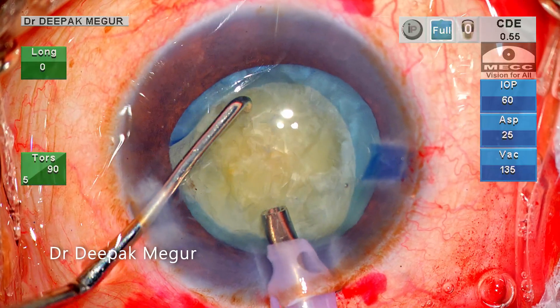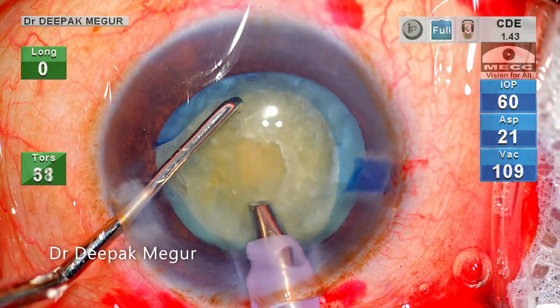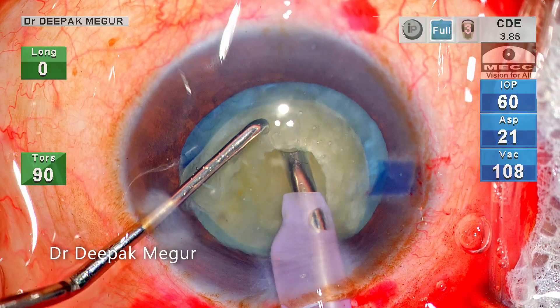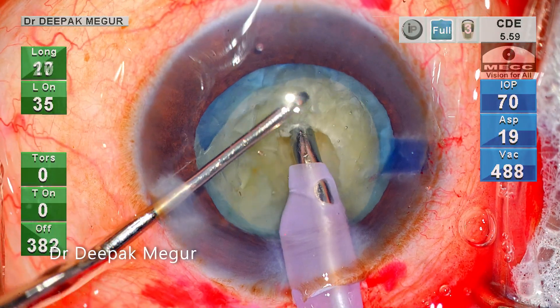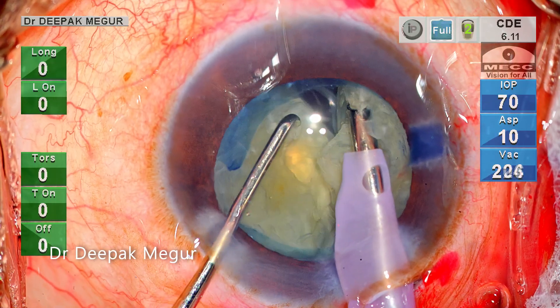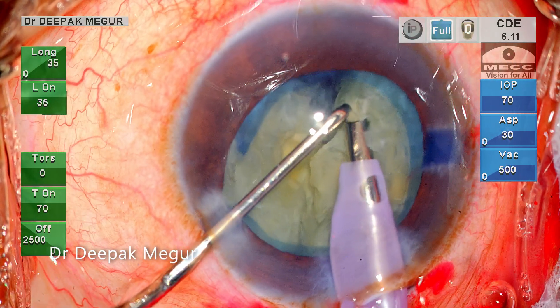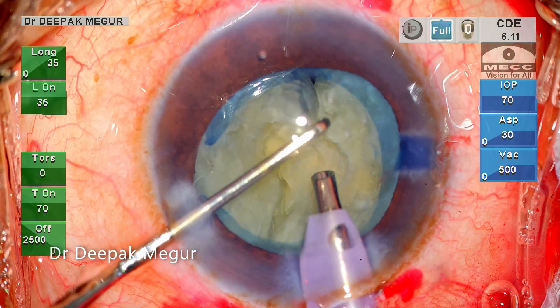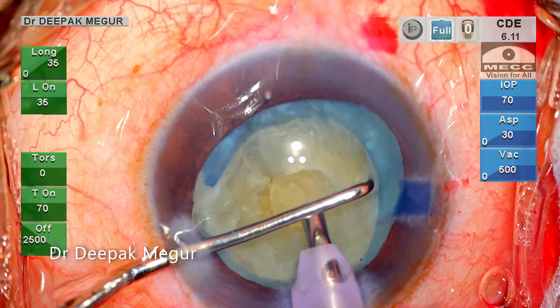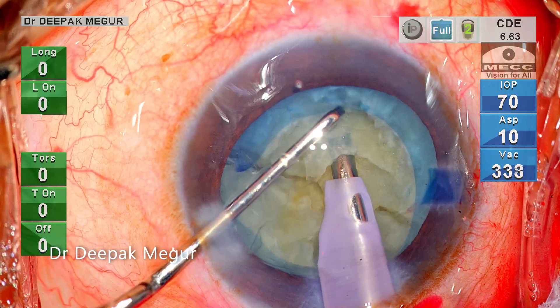Before performing the first vertical chop, I am creating a small trench by sculpting the central part of the nucleus. The idea is to get a good purchase of the central core of the nucleus. The first chop is done, and as I am laterally separating the fragments, I am conscious to be very gentle with my lateral separation maneuvers. The idea is to prevent any stress on the torn edge of the anterior capsule.